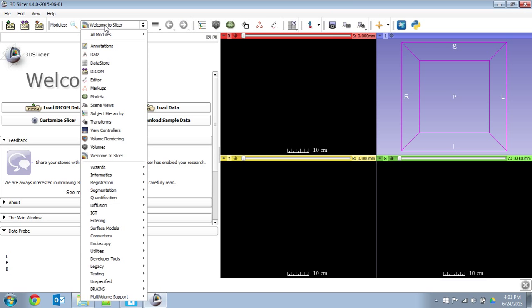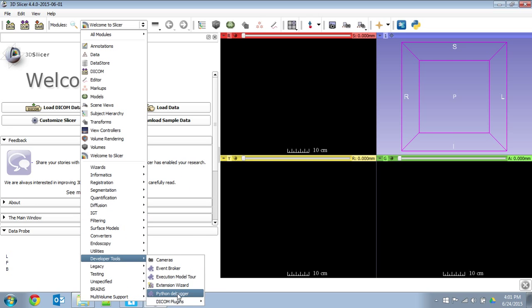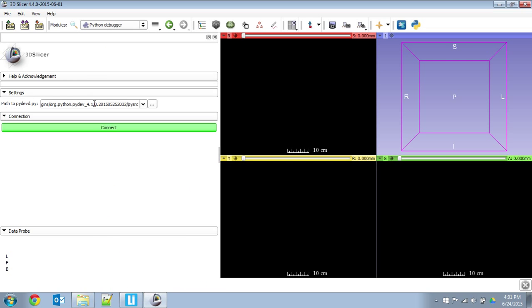So, now, in your list of modules, you'll find the Python debugger module, which is great, and then just to check that mine loaded correctly, yes, great. So, we're going to go to the Python debugger. Pretend that's empty, because obviously I've already had this set up and using it. So this is what you'll see upon first load of the Python debugger.